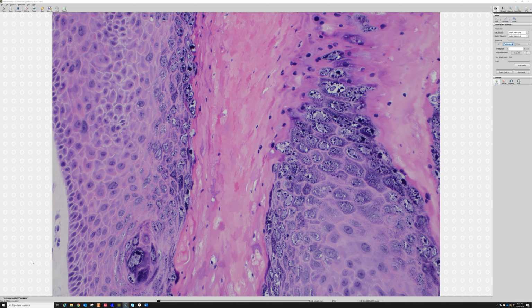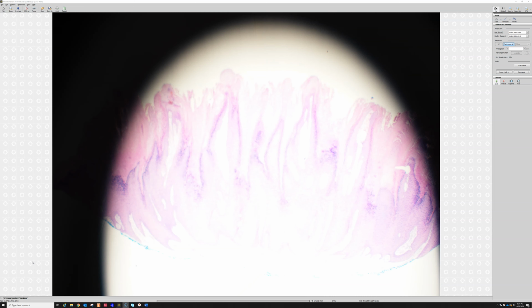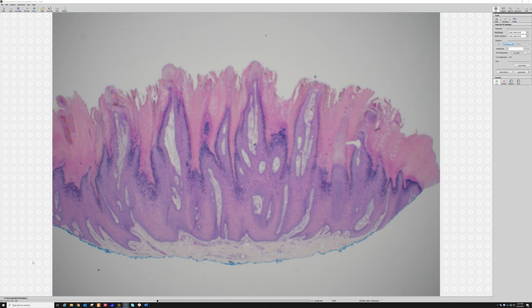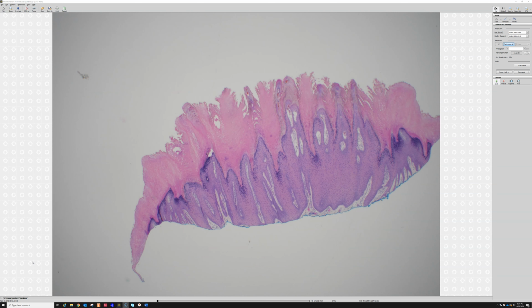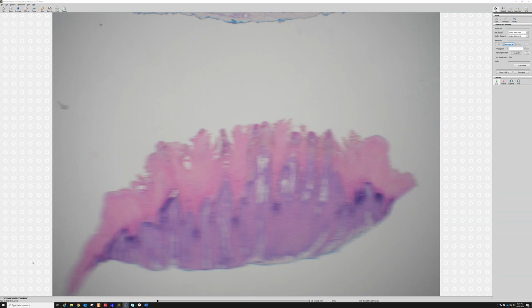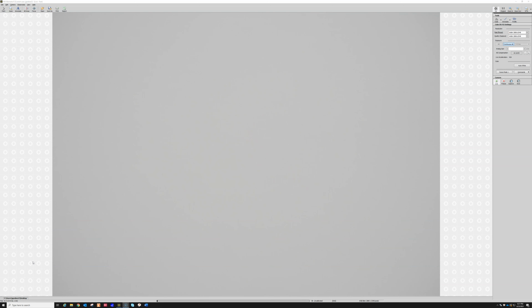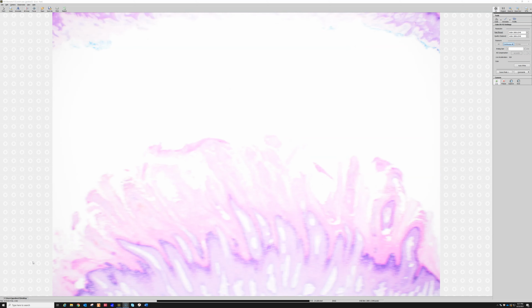Very nice example. All right, so I think we've seen all of the possible things to learn from this nice Verruca vulgaris here. And there's the blood in the tips again. Let's see, the hemorrhage. All right, so now let's look at some more at a faster pace, now that we've gotten all of the major features touched on.